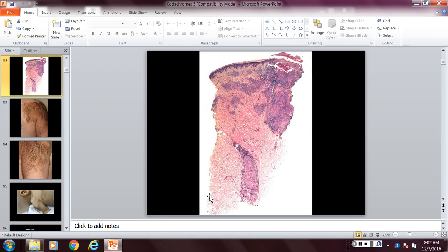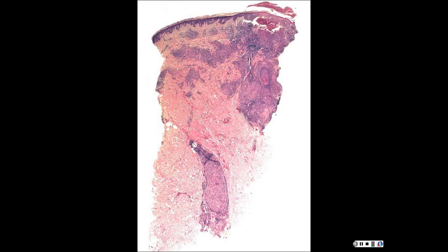I don't have notes on there. So someone gave me the slide. It is always about the differential. I can actually check my notes at home. I can probably tell you exactly what it turned out to be when they worked it up. It looks granulomatous, and it's around neurovascular bundles, so it absolutely could be leprosy, could be tuberculosis, could be atypical mycobacteria, so infectious granuloma and sarcoid is basically where we are.